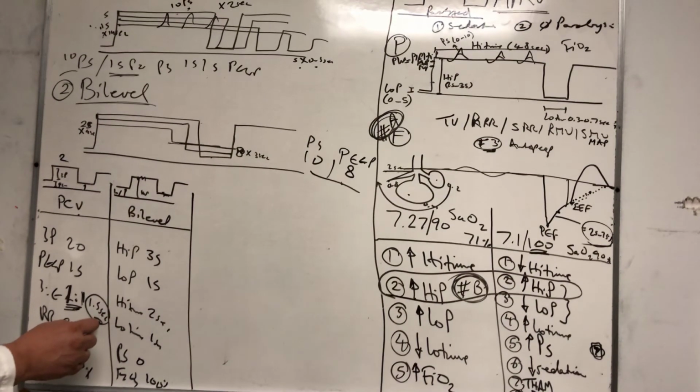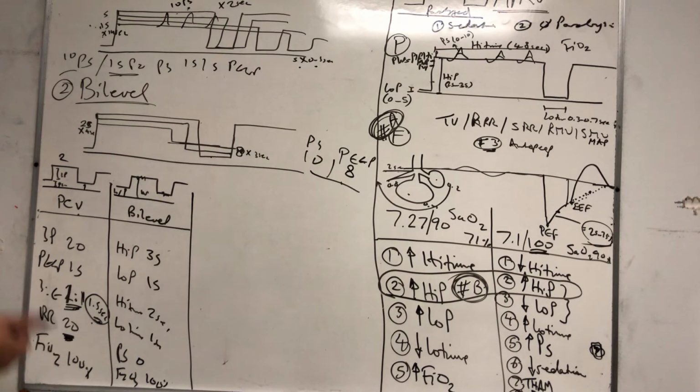All right, anyway, so 1.5 seconds, okay? So that caused the problem. Every time you wake the patient up, if you're taking too long to put them on pressure support, they're actually inversing their own ratio and resulting in problems. There are some parameters that we can play with, I'm not going to bore you with it, that can do that, but it also causes other problems.